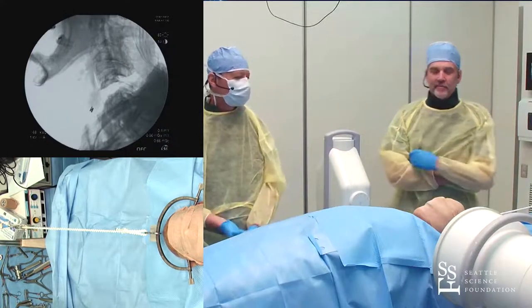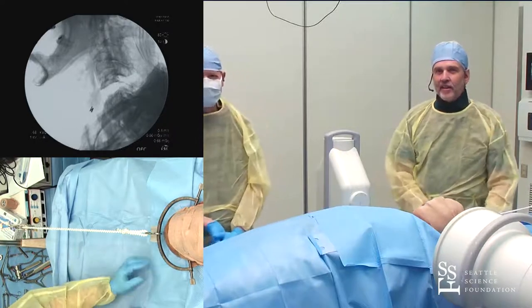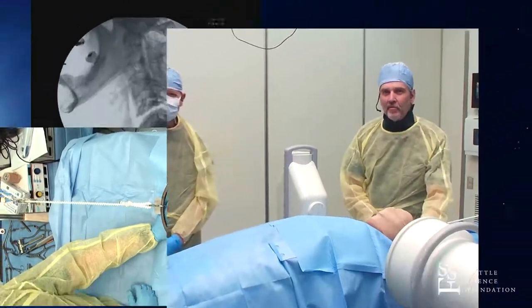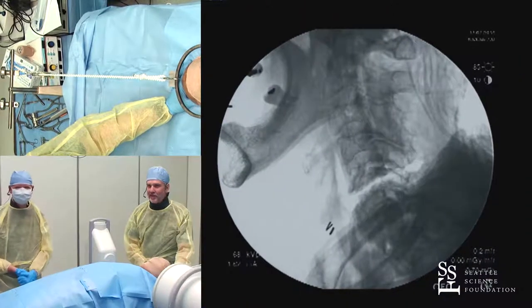Five pounds and check — especially the OC junction, where over-distraction could be disastrous. Go ahead and take another shot, because we'll need to push the head back to make sure the facets are locked up again.